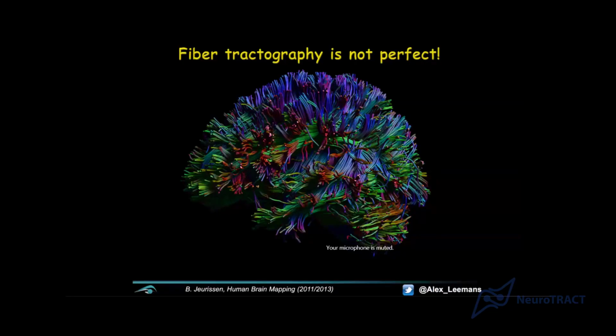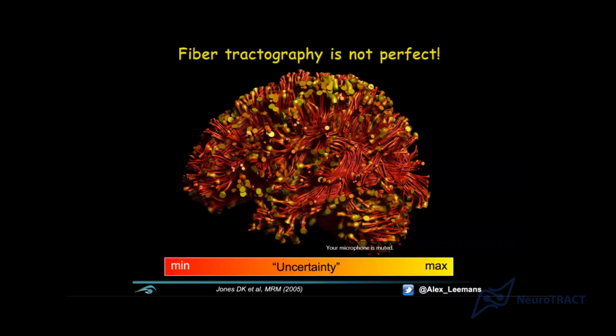this boils down to the fact that we're looking at indirect connectivity reconstructions. Okay? When I show a tractography result like this, you see the pathways. But I could also show the same tractography results like this. Obviously, this is kind of a weird trumpeting brain-like approach, but what I'm showing you here is I overlay on top of the tracts the uncertainty associated locally along the tract. And the more yellow, the larger the uncertainty, and I actually even provide a width, the thickness of the tube locally being thicker, representing more uncertainty.